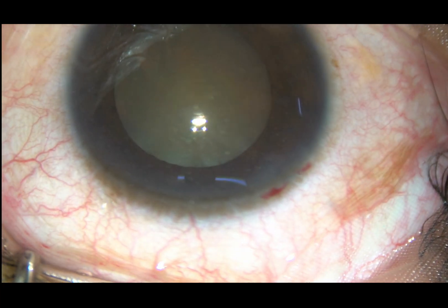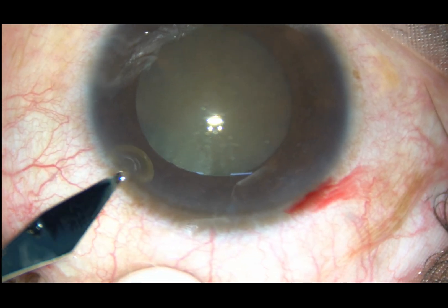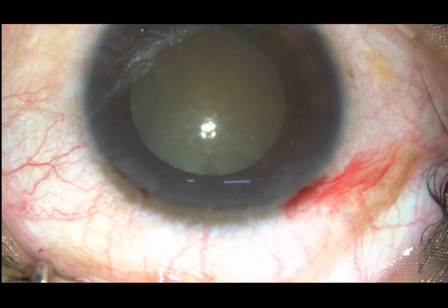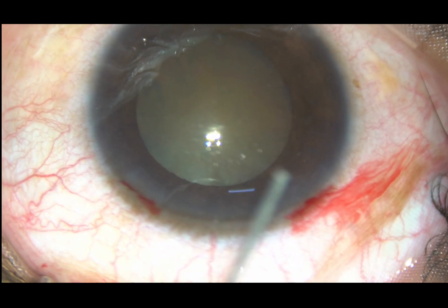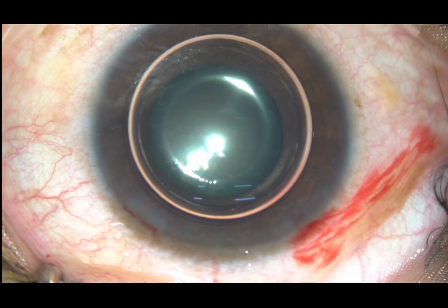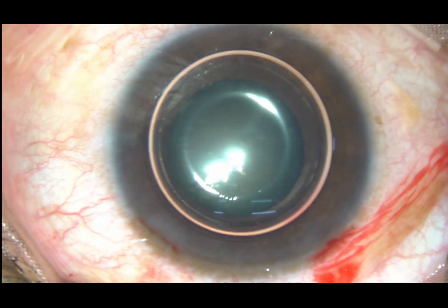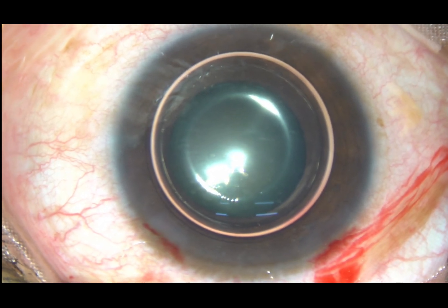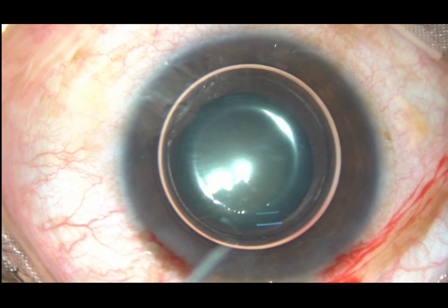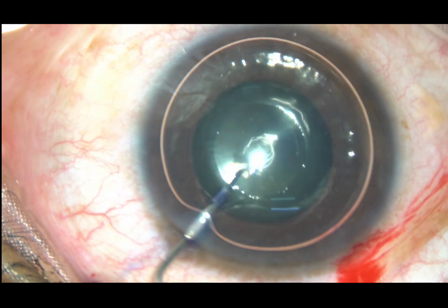The main incision has been placed on the posterior aspect of the limbus. There is a side port on the left side of the main incision. An air bubble is being injected, and then trypan blue dye is injected beneath this air bubble to stain the anterior capsule of this cataractous lens. Here goes the dye.